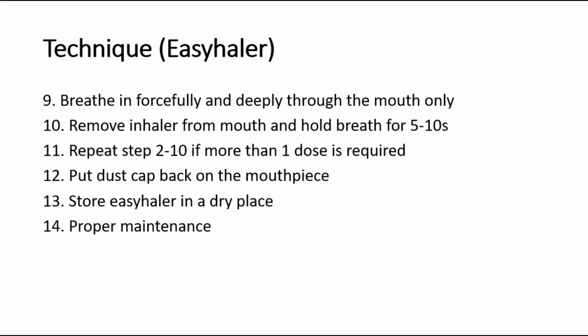Proper maintenance includes cleaning the mouthpiece with a dry clean cloth. Never use water or any other fluid when cleaning the mouthpiece. And the inhalation powder should not be exposed to humidity. So if the powder becomes damp, it is not suitable for use and should be disposed.